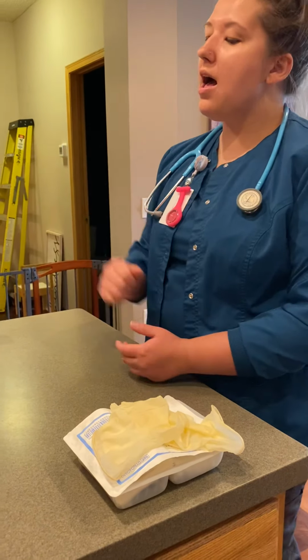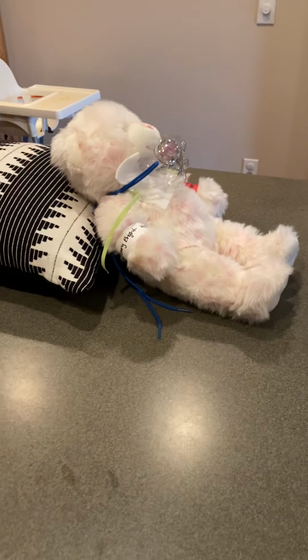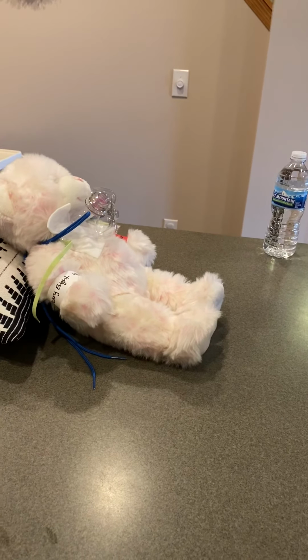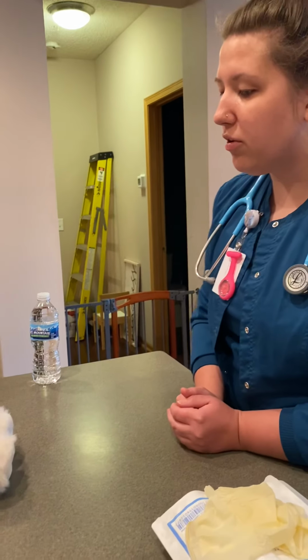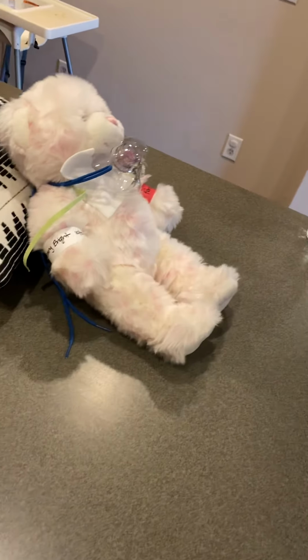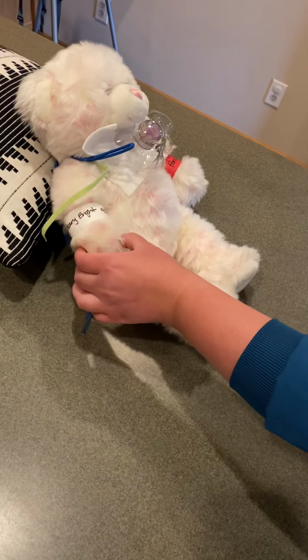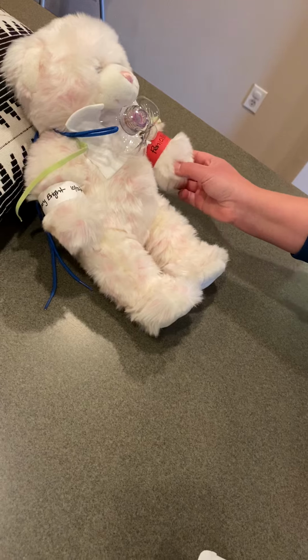So knock, knock, knock. Mrs. Bright, can I come in? Hi there, Mrs. Bright. My name's Abby, and I'm going to be your nurse today, and I am going to be doing some trach cares. So can you tell me your name and date of birth, please? Okay, and do you have any allergies? Perfect. So I'm going to just verify that, and she said Mrs. Bright, date of birth 10/12/93, and allergy to penicillin, which that is there.